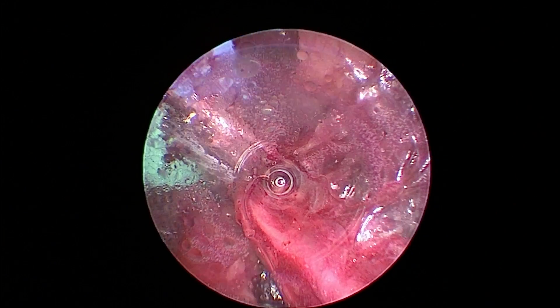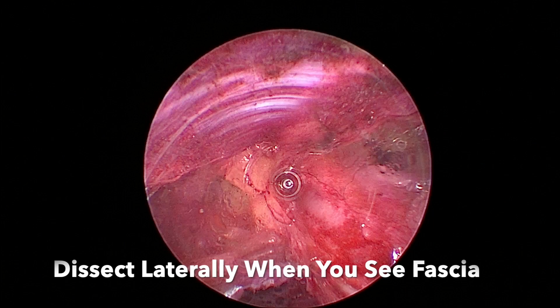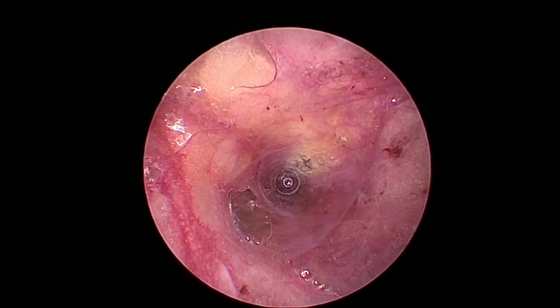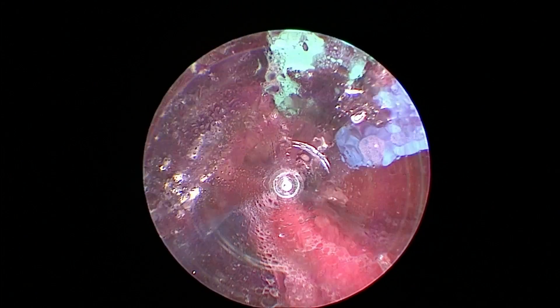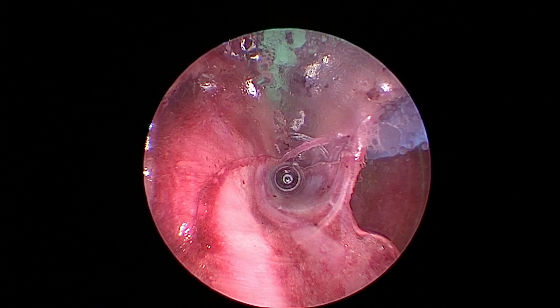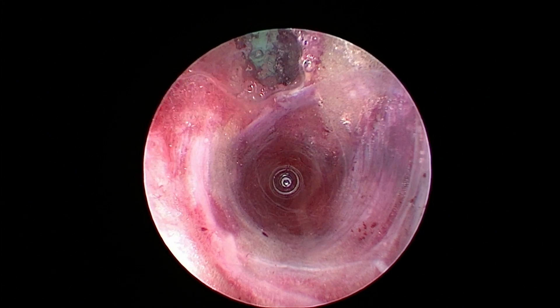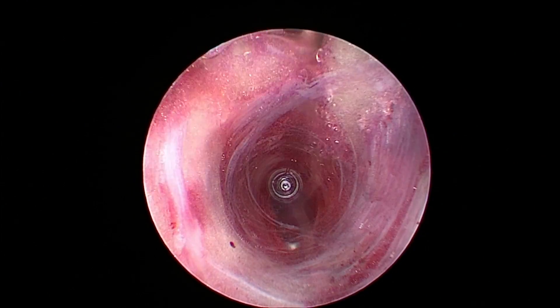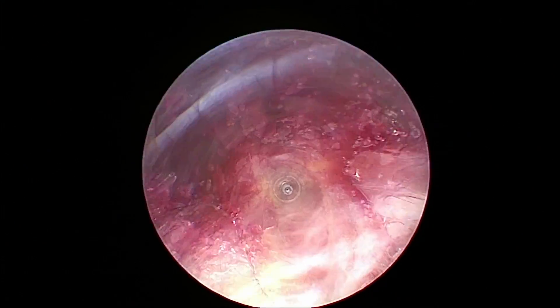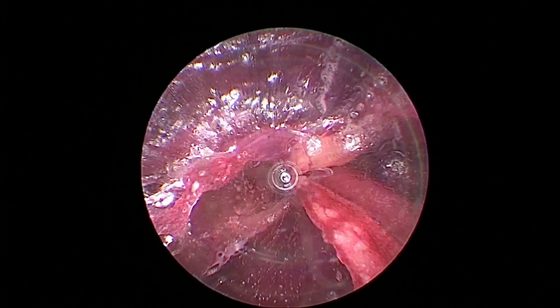I do the fasciotomy — I'm never pushing this tip over top of that radial artery underneath the fascia. When you see the fascia, just dissect laterally, move laterally, and that will keep you off the radial artery and open the tunnel up. Now I have enough space to take that branch I was working on earlier. There's the vein, there's the artery, there's a branch of the artery — I'm going to carefully cauterize and cut that. I remain lateral to my pedicle. I just want to keep that pedicle intact the whole way. Here again I create some space above the fascia, which allows me to sneak in with my bipolar cautery and do the fasciotomy.